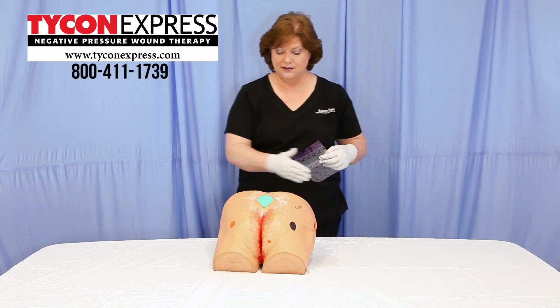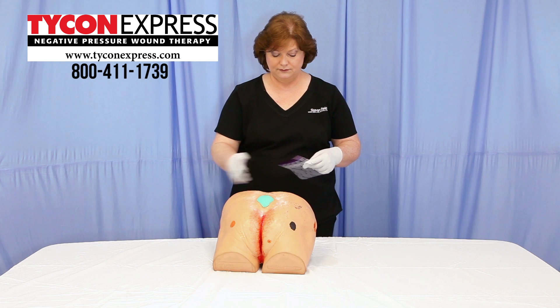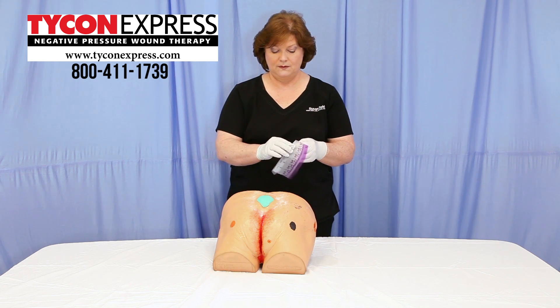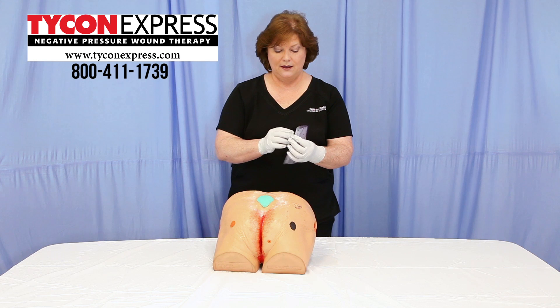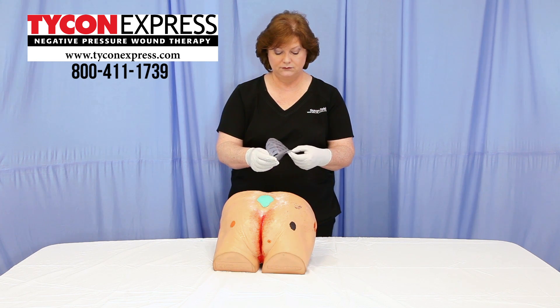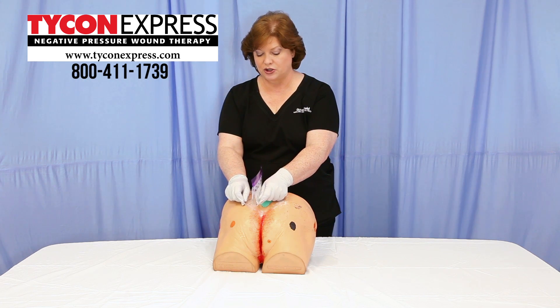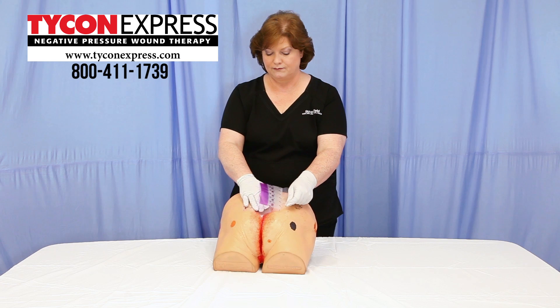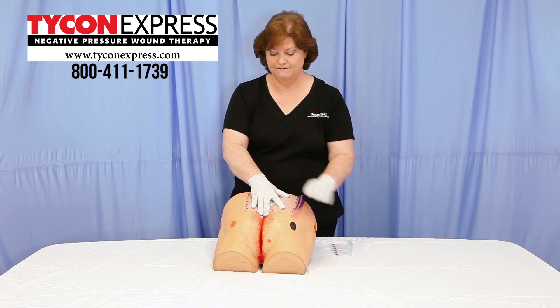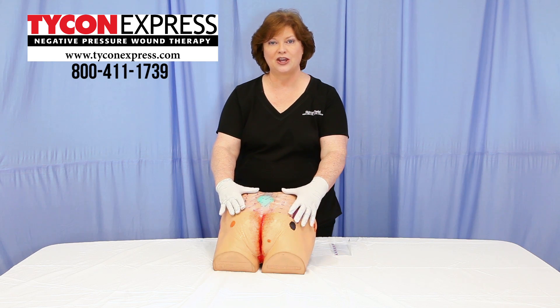Once complete, allow everything to dry well, then apply your transparent film as you normally would, allowing a two-inch margin around the wound. That's the technique for crusting. Thank you.